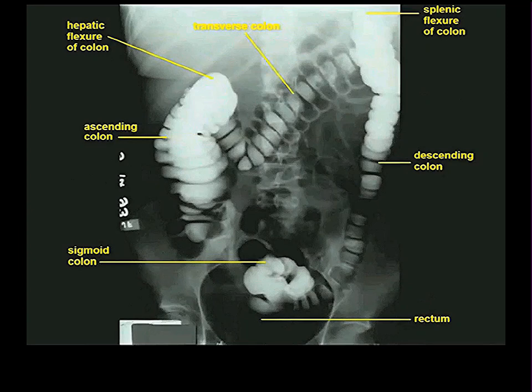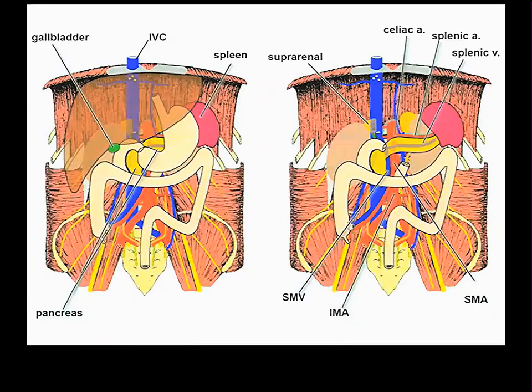And that's what's happened in this person. They had a barium enema, and you can see the sigmoid, and you see the things that are labeled. However, more than anything, when you want to study the bowel, you will do a CT scan of the abdomen. You usually do it with a barium swallow as well. You have to drink a lot of barium. And I'll show you a CT of someone who's done that. And CTs of the abdomen, extremely common.